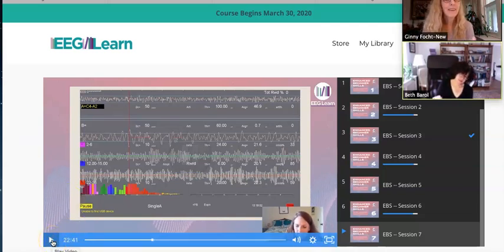Say that again. I'm the slow wave, and you're the fast wave. I am. And today, I couldn't figure out how to do C3 minus C4 without looking everything up, so I just did CZ minus A2. And when I was working, I could see right away, all of my waves are too high, but especially my beta. And in between, in rest periods, I would stretch and try to get my shoulders and my neck to just kind of chill out.